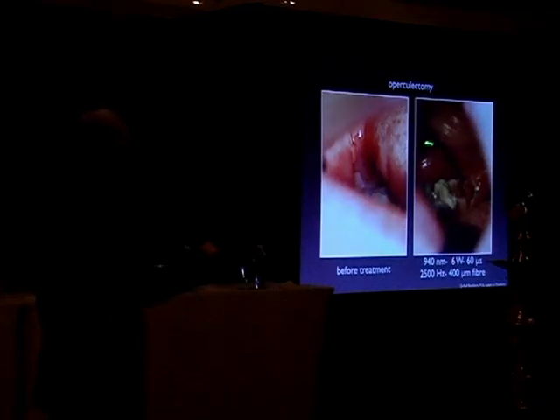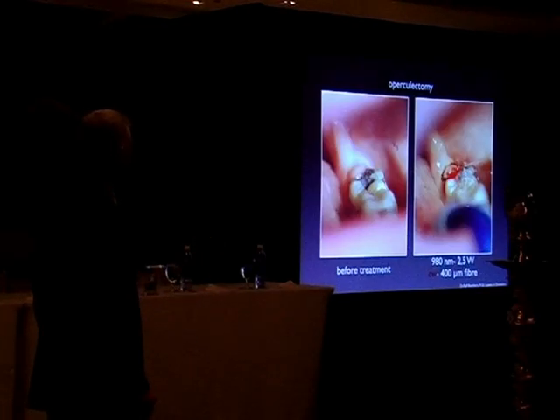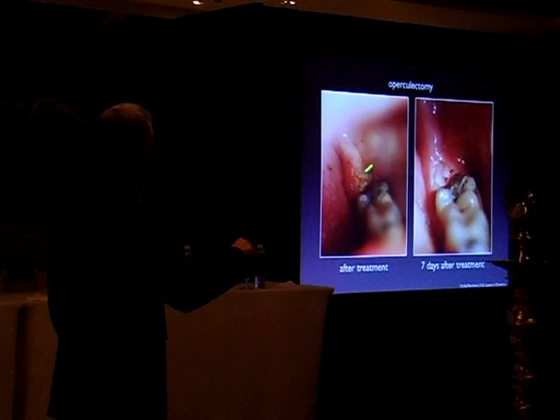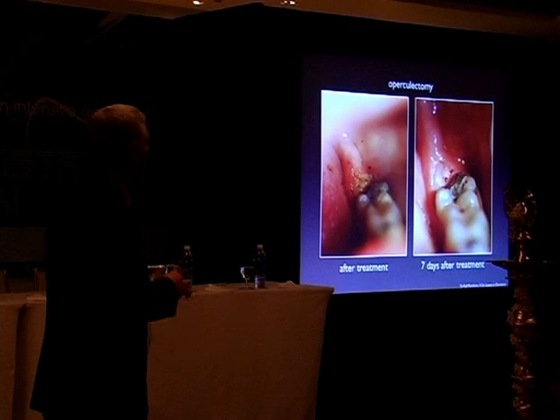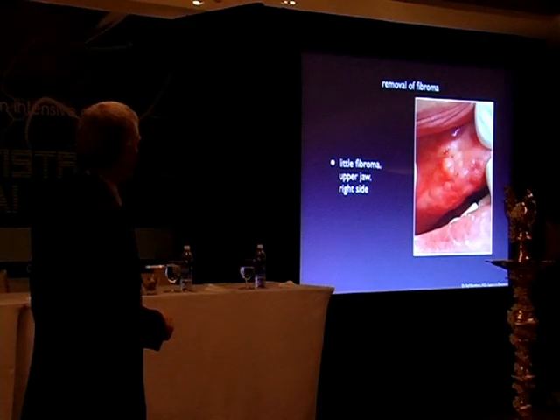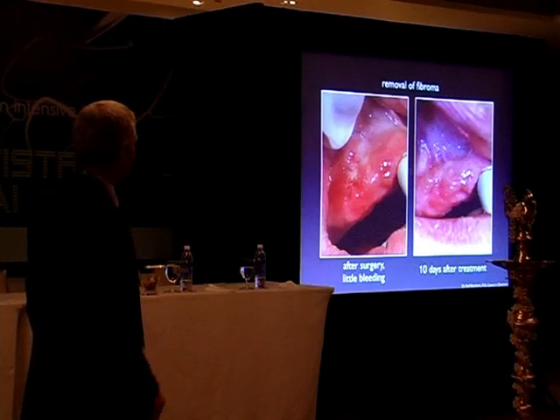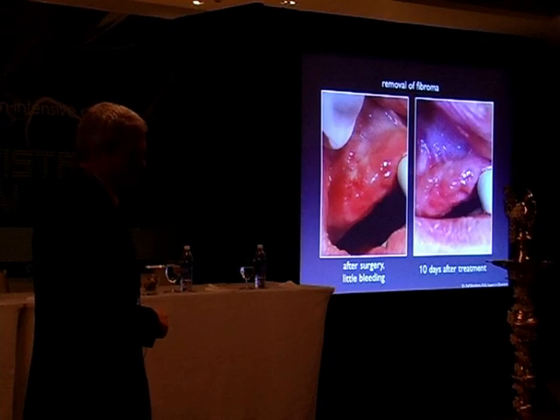Second case, done with a 940 diode, directly after treatment, 7 days after treatment. Now this is done with a 980 in continuous wave mode, after treatment and 7 days after treatment. It's not looking as nice as with the others, and that mainly depends on the continuous wave treatment. Removal of fibroma, first done with an erbium chromium YSGG, long pulse, as I said. This is directly afterwards, and you see there's only little bleeding.